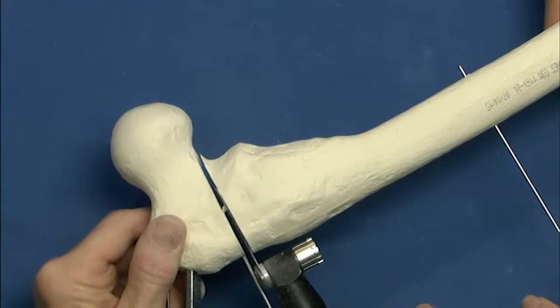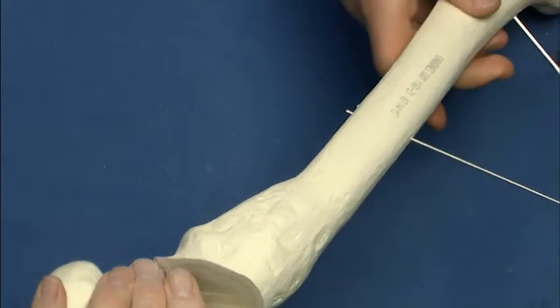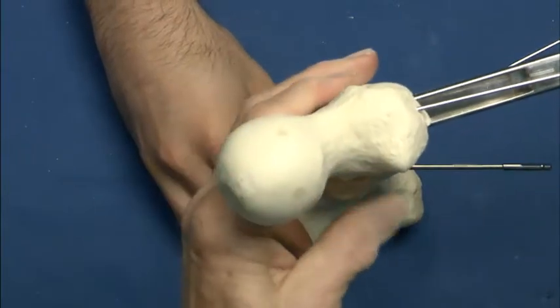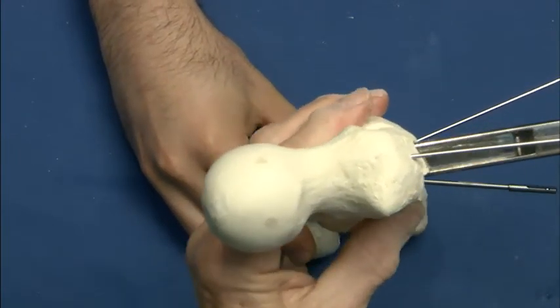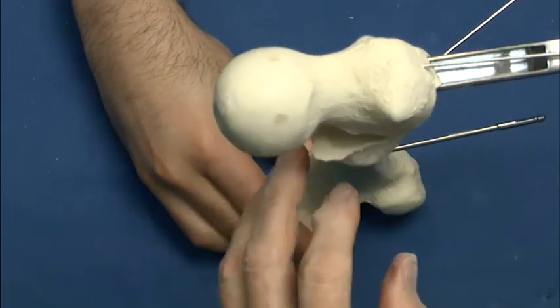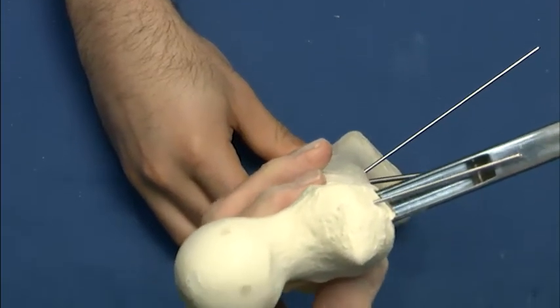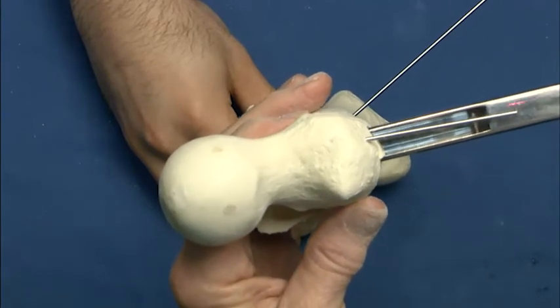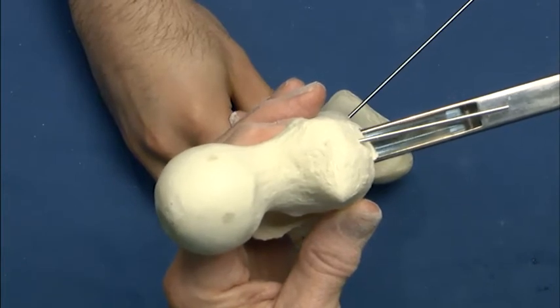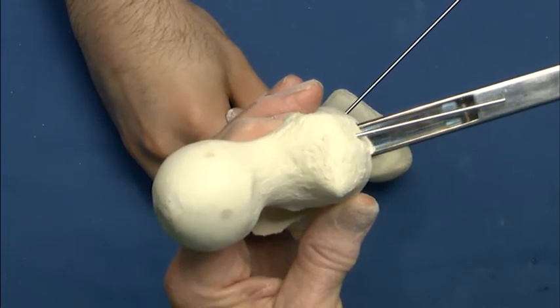Okay, so now we've completed this component, and now what we'll do is go back to our horizontal plane. We'll take out this reference. Before we take our closing wedge, with this position, we're going to line these up. And if you look at what that does to the position of the lesser troch, because of the medial rotation, you can see where the horizontal plane correction comes in. That's too much. I can't really hold this while we're going to cut it, but what you can do is mount the proximal segment in the vise and hold the distal segment while you do your closing wedge here.